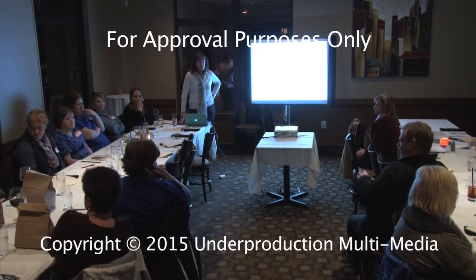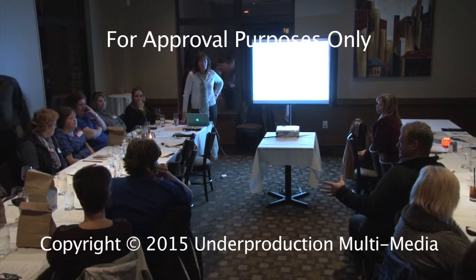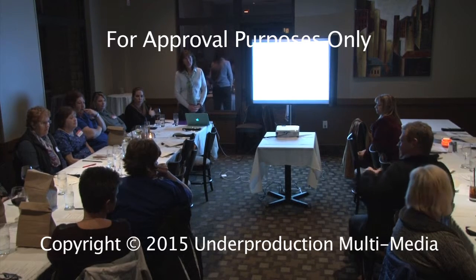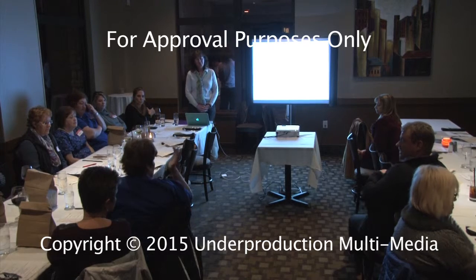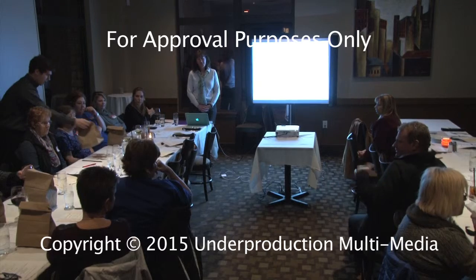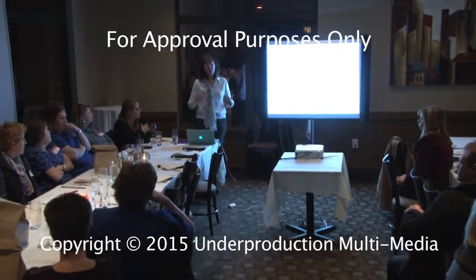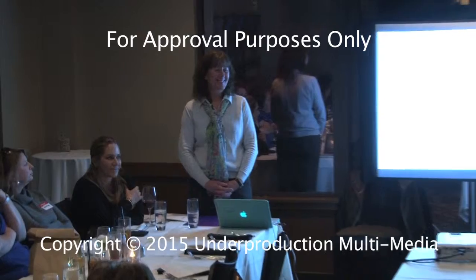We would not put the PICC line in because the vein was too small, and then send them to radiology, and the radiology DVT rate was 14%, and ours was 1.4%. So yes, we avoided the DVTs that we caused, but the patient still needed access. But the PICC is not the end-all, be-all for every patient, and that's what we have to remember as vascular access specialists.